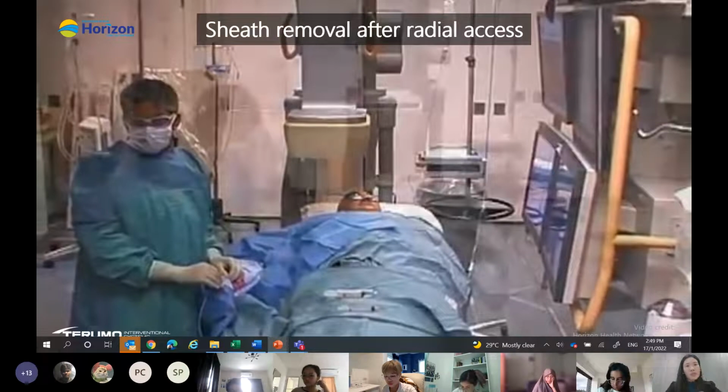So now I'm going to show you the last, very general step of the procedure. You saw from even before the puncture, from the patient ward preparation up to the cath lab preparation. They puncture the needle, put in some devices, put in some contrast, check the conditions, discuss whether the patient needs to proceed with treatment.